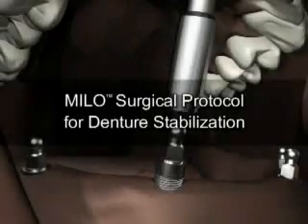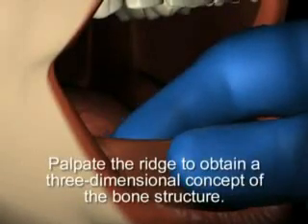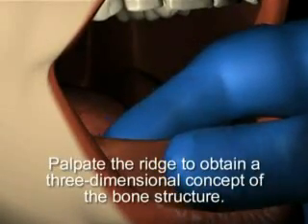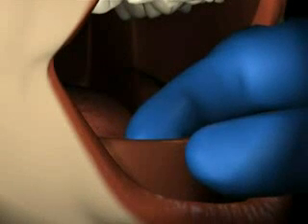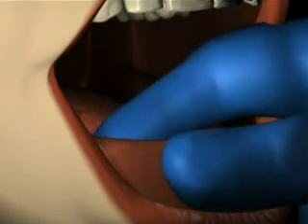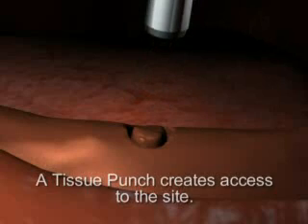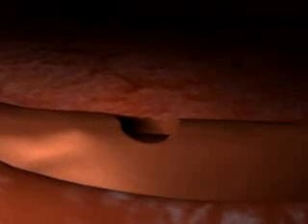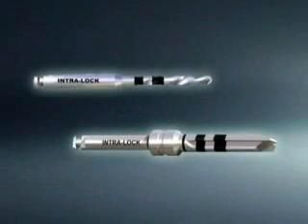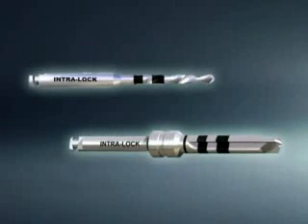The following sequences demonstrate Milo surgical and restorative overdenture protocols. Palpate the ridge to obtain a three-dimensional concept of the bone structure. Ridge calipers and a dental probe can be employed to determine the location and depth of the surgical sites. A tissue punch may be used to create access to the site; a full thickness mucoperiosteal flap may be employed if indicated.